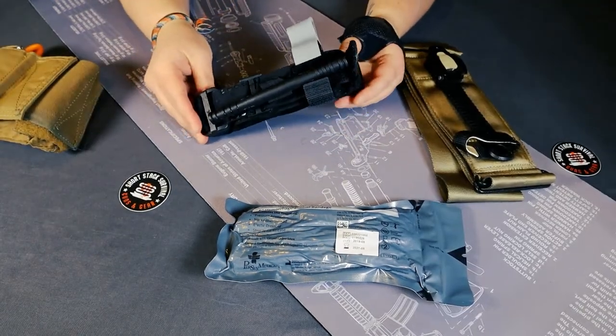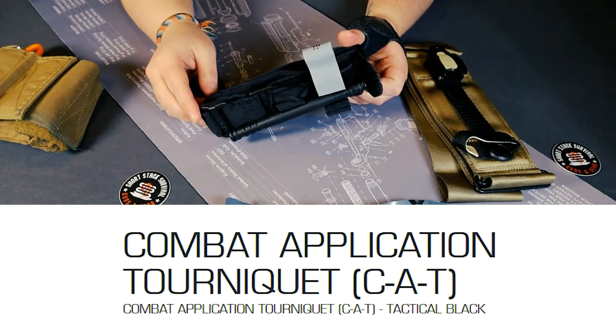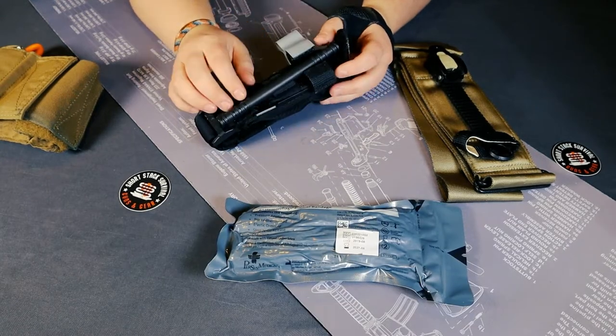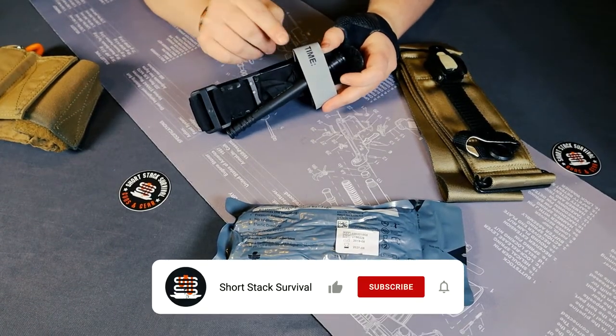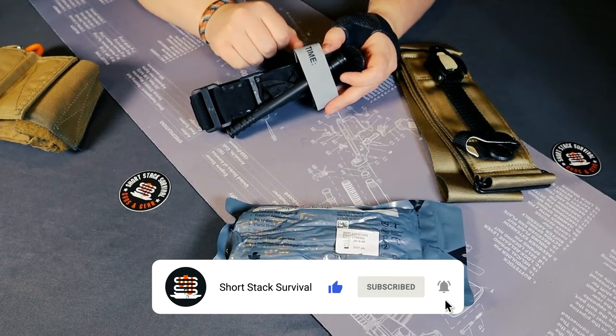This is probably the most common tourniquet that you'll find — a CAT tourniquet. I believe this is a CAT 7, the 7 being the 7th generation of this CAT tourniquet. You'll see you have a windlass here — this plastic part — and you have the time band. If you keep a sharpie with your tourniquet, you can write the time that you applied the tourniquet.